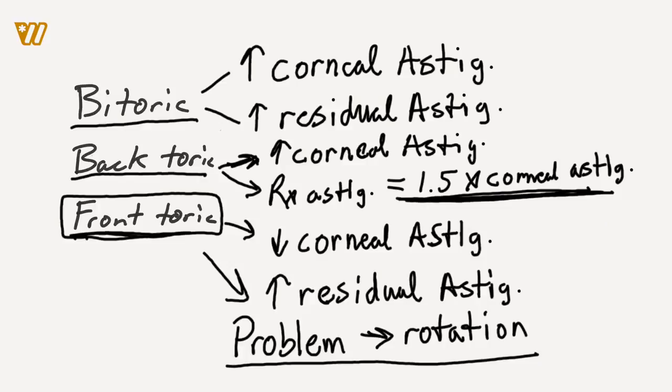Now, if you look in your text, there's going to be a really nice box of generic GP contact lens rules, and it's essentially what we've written here on the board in that box. So I've simplified that down to do some arrows here, so I'm hoping that's helpful for you guys. But if it's more helpful for you to see that box, then just highlight that box, and that's the important stuff you guys need to know as you are moving forward with your board's preparation.